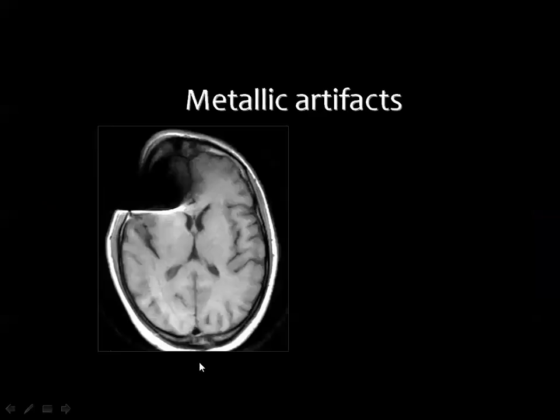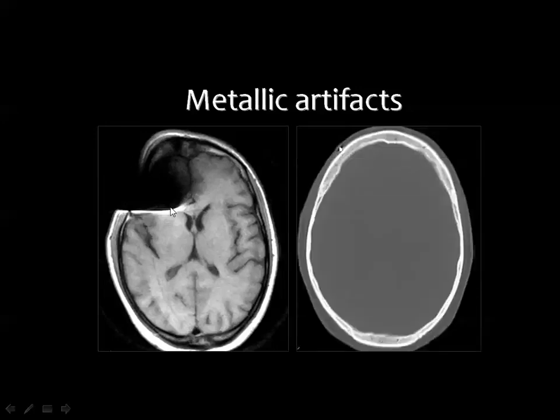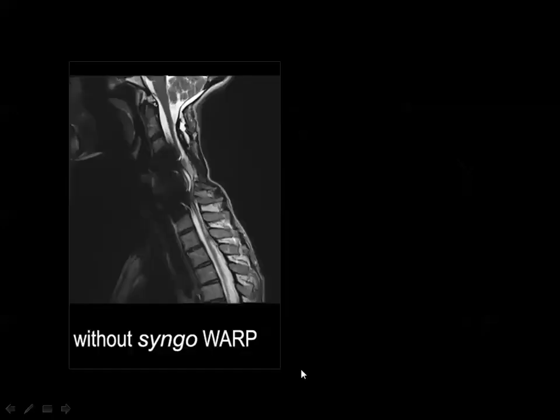Then what happens if the patient had a metallic object that is not compatible with MRI? It will produce too much artifact that will mask a good part of the image. And you can see here, this very small metallic object will create such an artifact. But most of the recent MRI machines have software that can remove the artifacts, and this is an example.